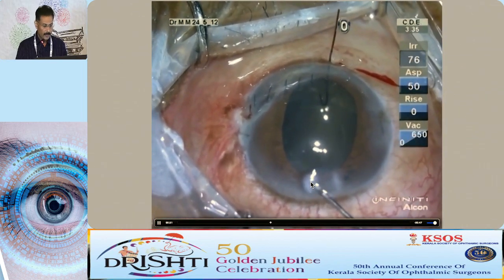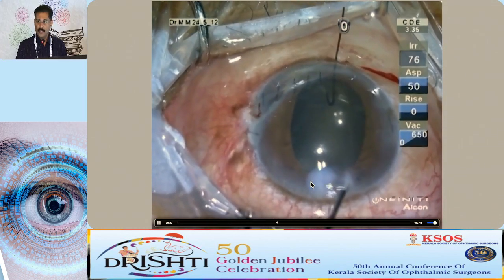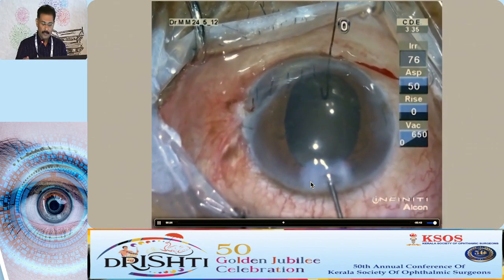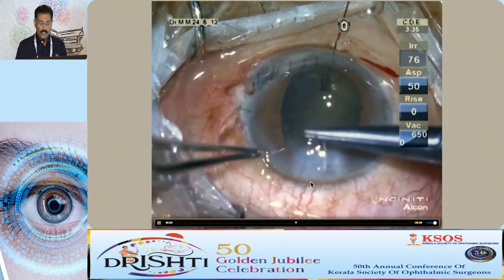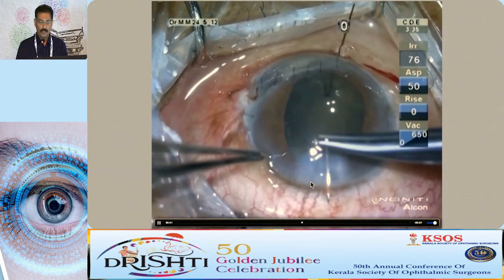but radial is easier to make, see, and do also. But here, see, this is a paracentesis. Still, it has been manipulated so much that a tight Simcoe was put in through that, and tilted, turned, and all those. So even if that does not close, suture that.